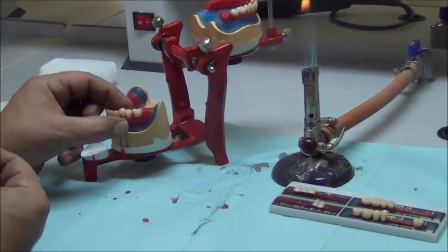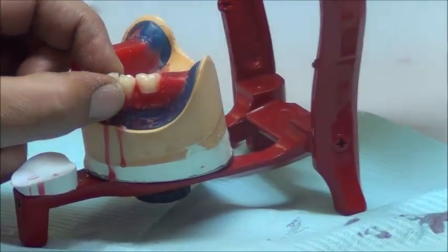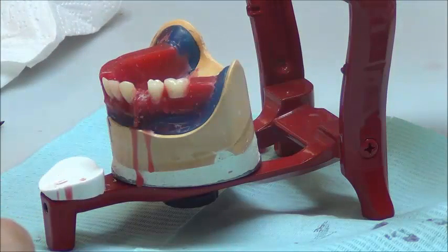We're trying to measure it. It's still not going in, so I could trim a bit more.